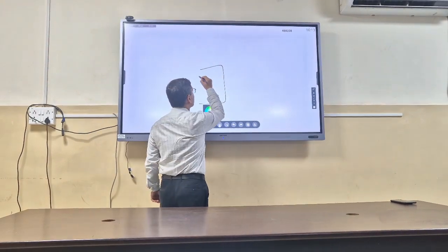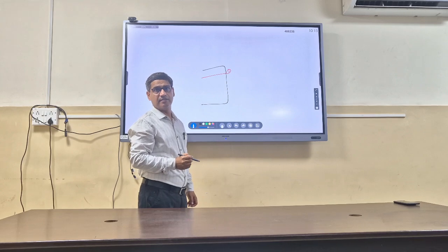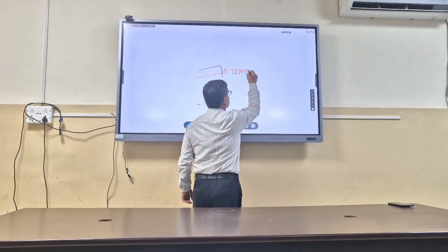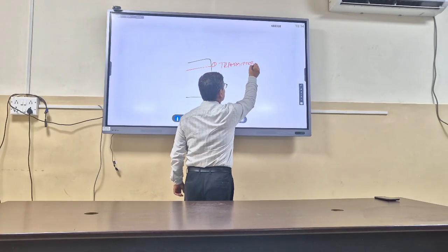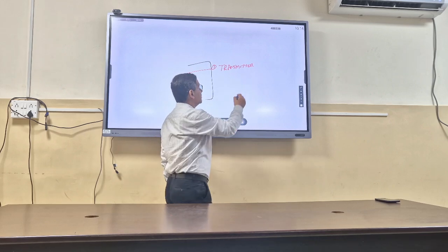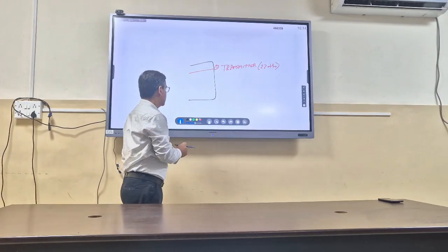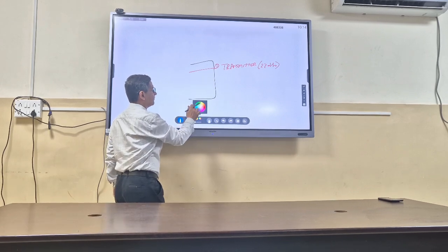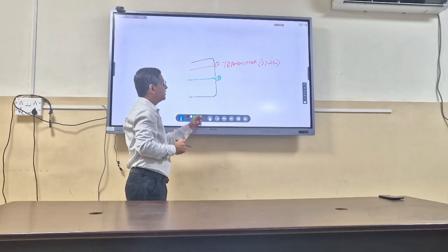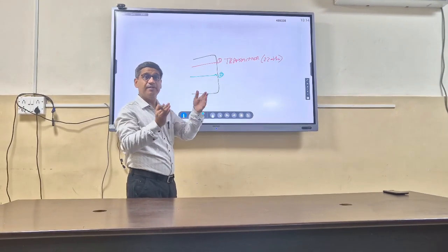The first channel, channel 1, is the transmitter. What will it do? It will deliver a sound of 220 Hertz to the ear. It's a very small plug that fits snugly in the ear, and inside it there are 3 channels.